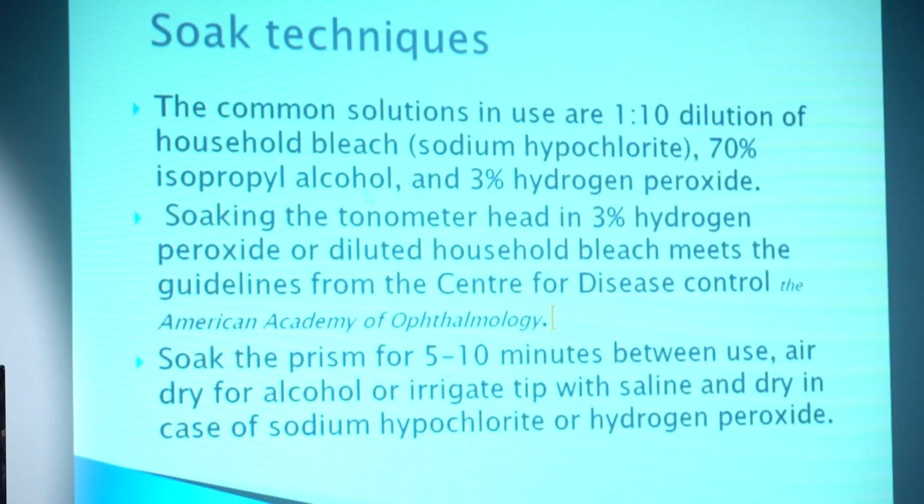So the common solution is to use a 1:10 dilution of household bleach, and soak the prism for 5 to 10 minutes between uses. Air dry for alcohol, or irrigate the tips with saline and dry in case of sodium hypochlorite or hydrogen peroxide use.